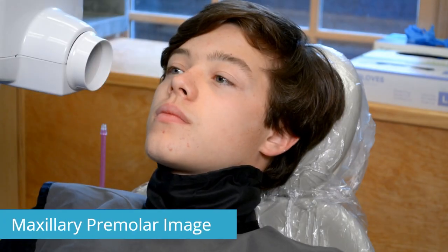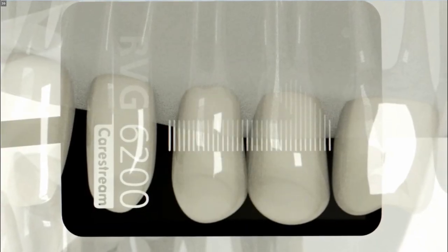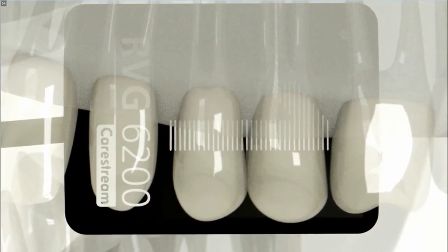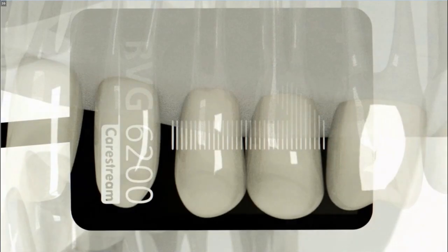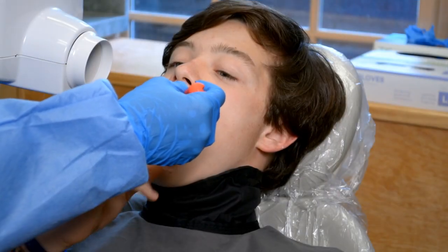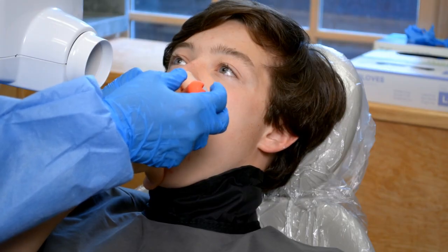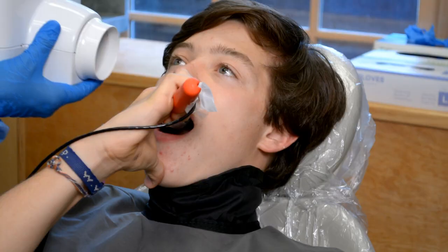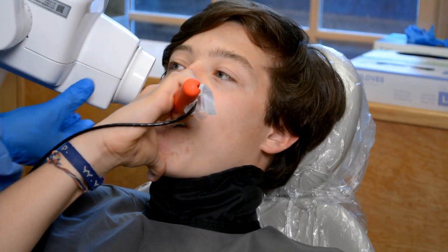Maxillary premolar image. To acquire an image of a maxillary premolar, place the sensor in the patient's mouth so that the anterior edge of the sensor is aligned with the mesial aspect of the canine. Position the sensor parallel to the long axis of the teeth, if possible, and verify the horizontal placement. Ask the patient to close their mouth.